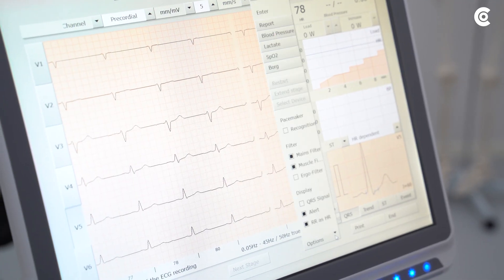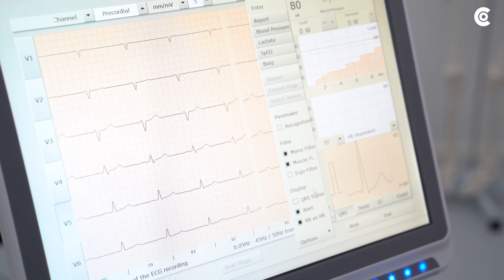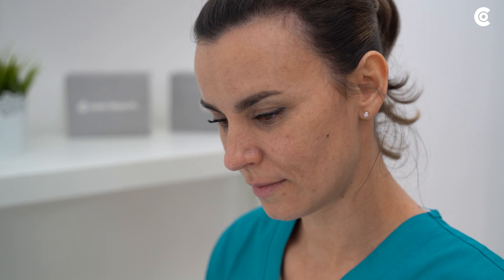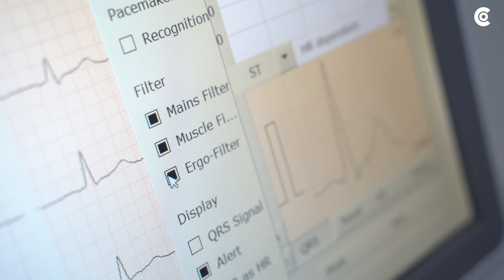Custo Med recommends using the mains and muscle filter to prevent disturbances in the ECG signal. If it is a stress test with high load, you can additionally activate the ergo filter to ensure a more stable ECG signal.